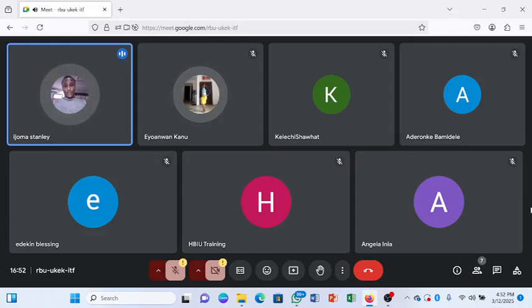They have the green cap bottles now. Here, the additive used is heparin. I think I mentioned heparin when we were talking about coagulation. That's agents that suppress coagulation. So heparin is a natural anticoagulant that inhibits thrombin. Thrombin is a sort of clotting factor in blood.